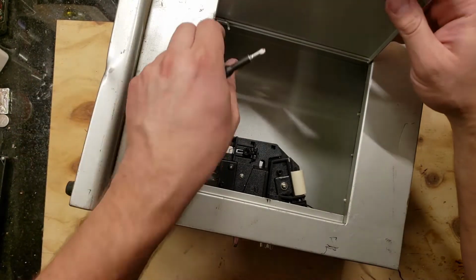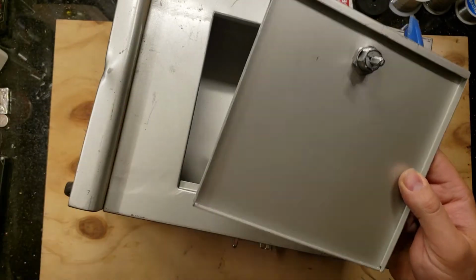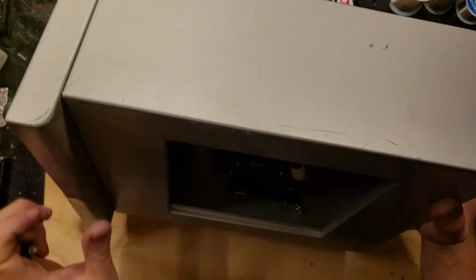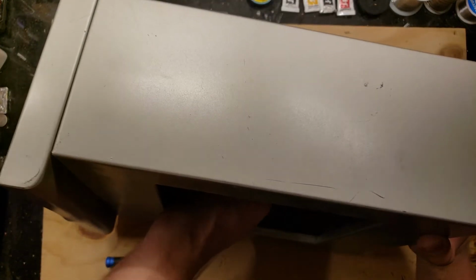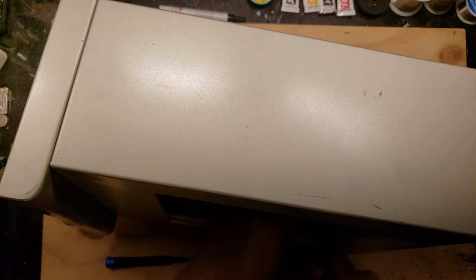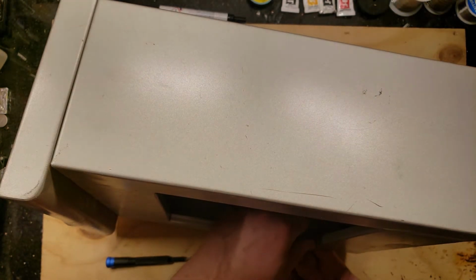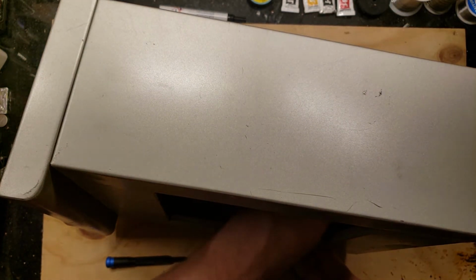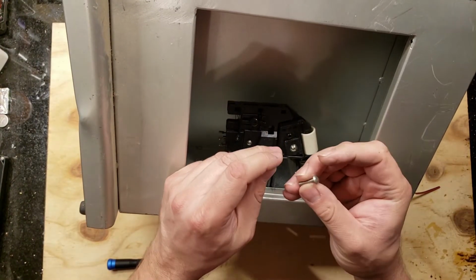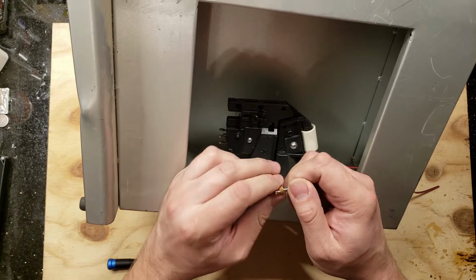So I don't think the rest of this, oh, actually the door comes off. So yeah, the door is removable. Oh, you know what? It's got some wing nuts in there, so it looks like I may be able to remove the coin mechanism. Okay, turns out it was attached with wing nuts, which looked like rivets, but I guess that's a good way of assembling it.